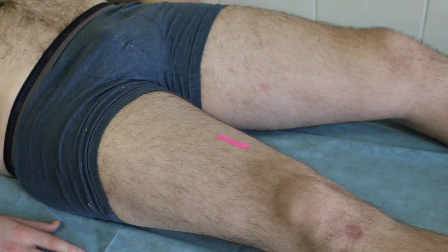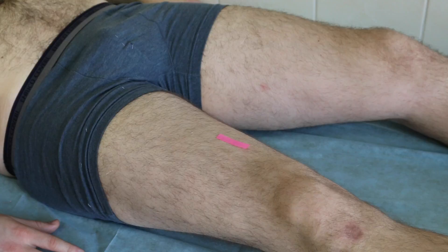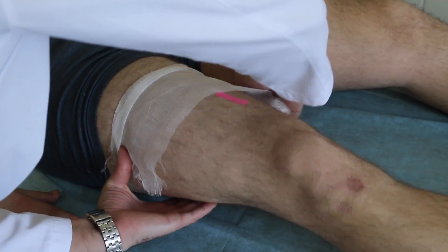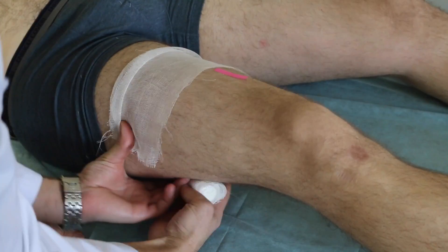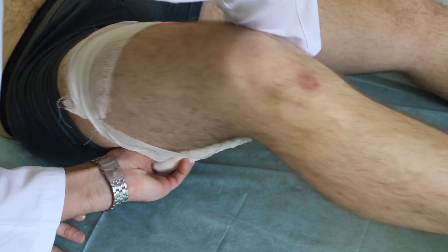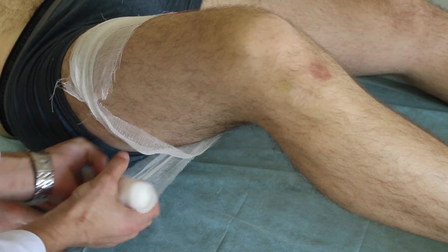In case of arterial bleeding, you should apply a tourniquet proximal to the wound. Your tourniquet should have some padding underneath it to prevent skin damage, so use the victim's clothing, pant leg, short sleeve, or gauze to place under it if you can.